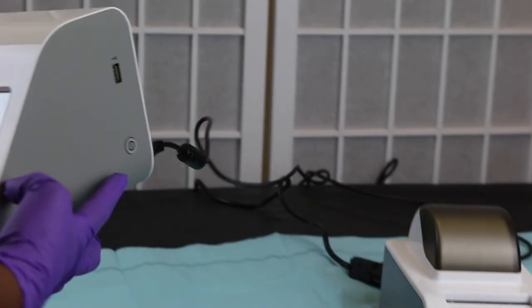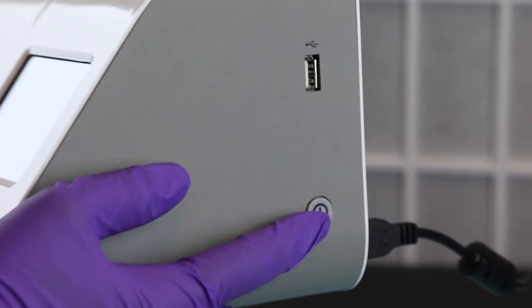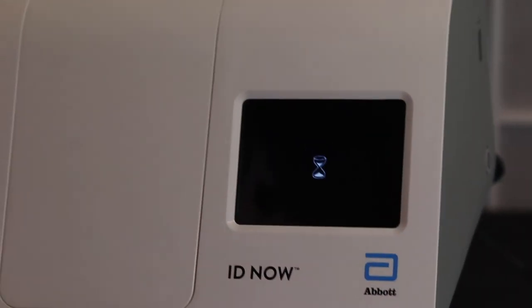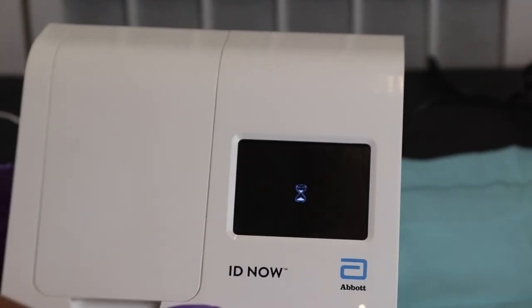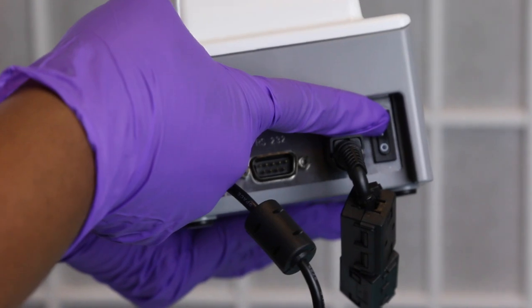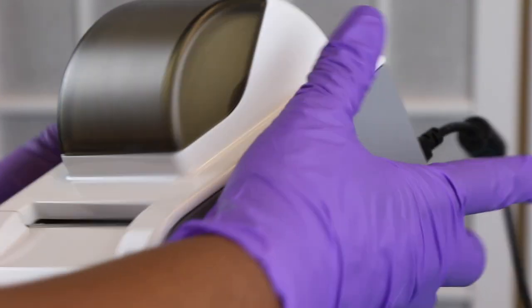Turn on the Abbott IDNOW by holding down the power button on the side for three seconds. You will see the display turn on and begin to initialize. Turn on the printer by flipping the switch on the back as shown.